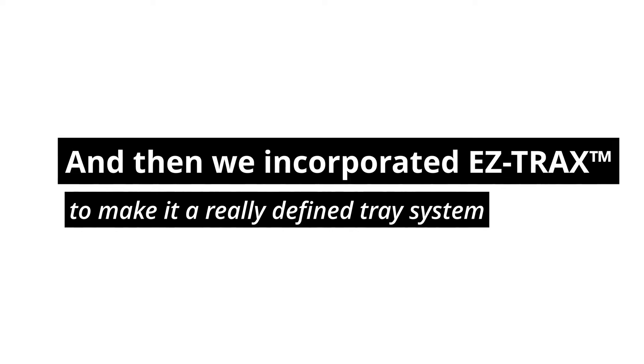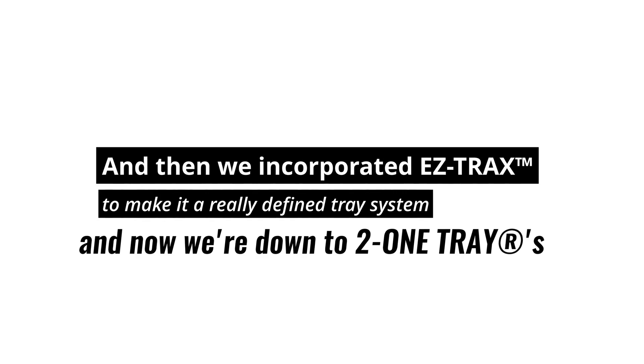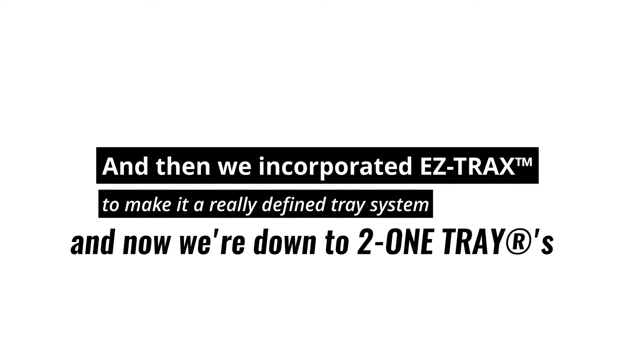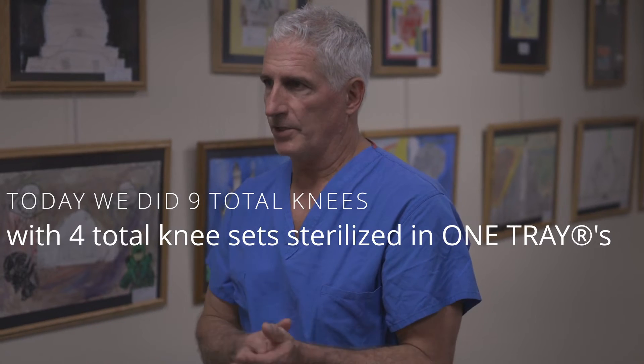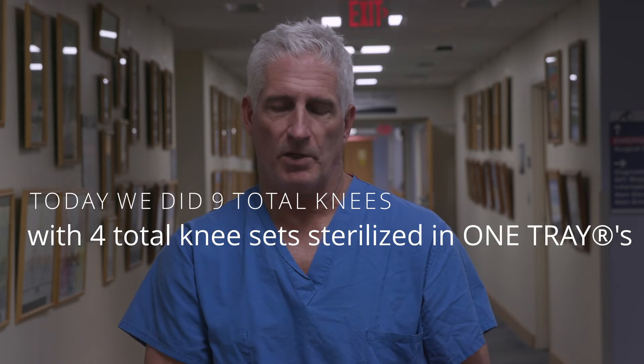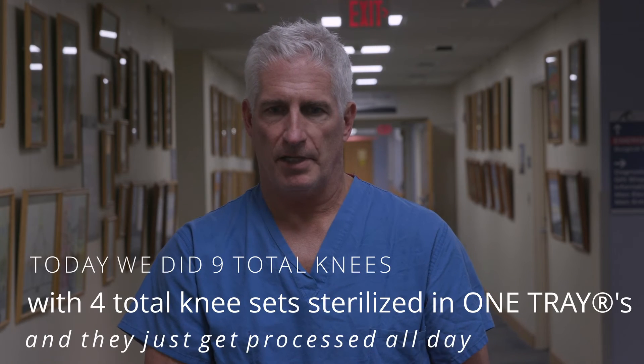Then we incorporated EZ-Tracks to make it a really defined tray system, and we're down to using two one trays for total knees now. Today we did nine total knees. We ran with four total knee sets that were sterilized in one tray and they just get processed all day.